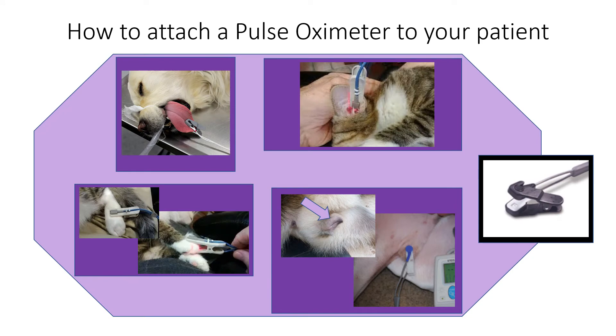The second accessory we're going to look at is the pulse oximeter. Pulse oximeters look like a clip — one side has a light and one side has a receiver. The light should be directed away from fluorescent lights.